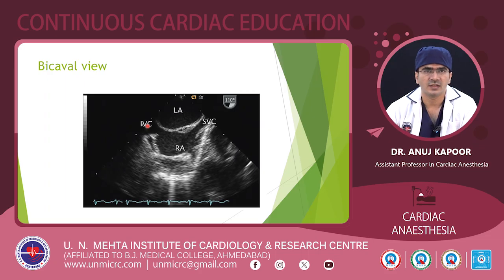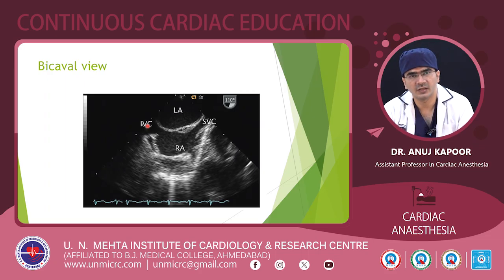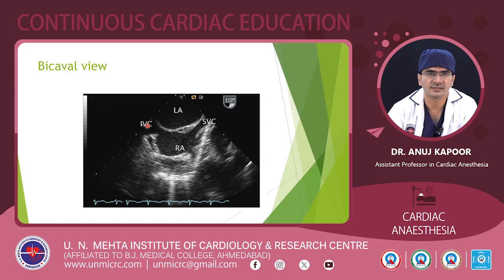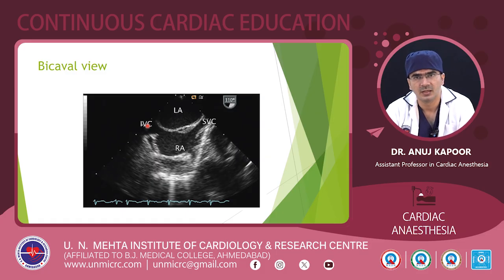Now moving forward, we will also get a good view of the ASD in the bicaval view, as we have earlier discussed, and we will get to see the SVC and the IVC and the RA. This is a good view to put the color Doppler or spectral Doppler to assess the flow, and also to assess the anatomy of the interatrial septum. In this image, we can see a flap-like valve in the interatrial septum.